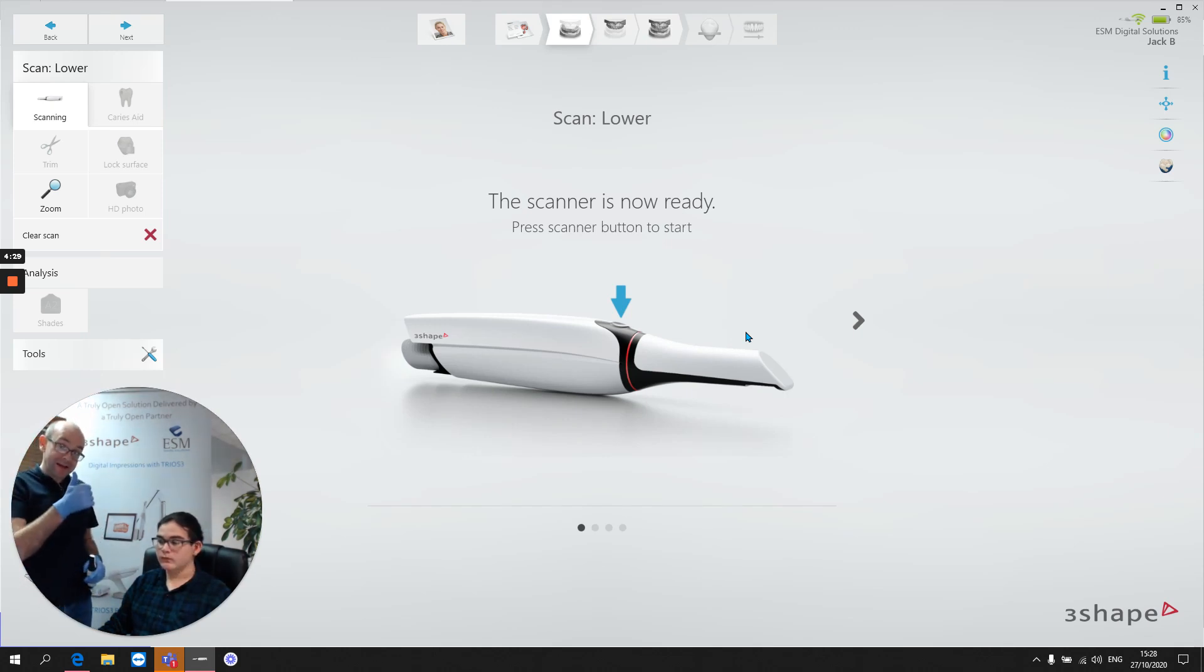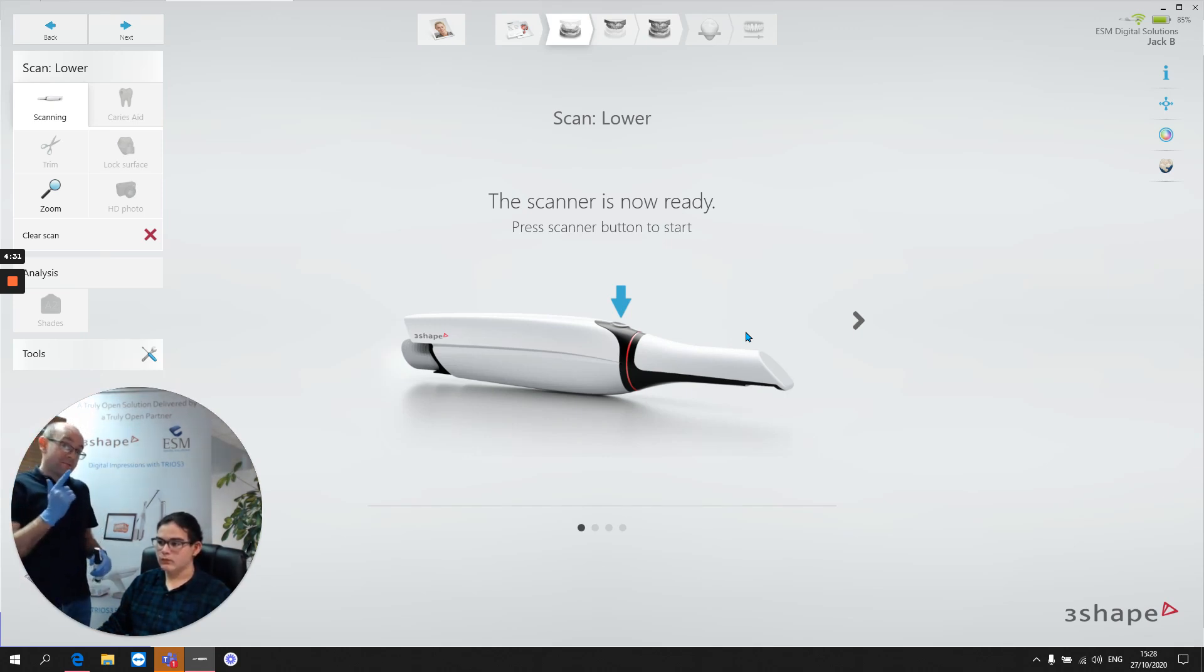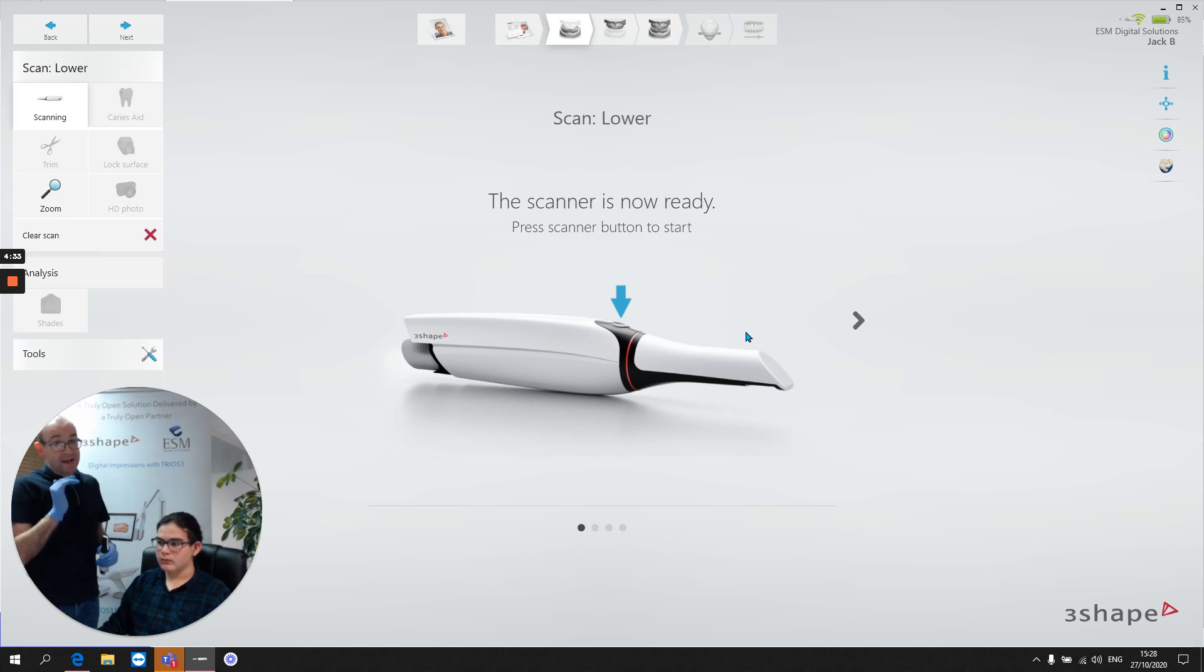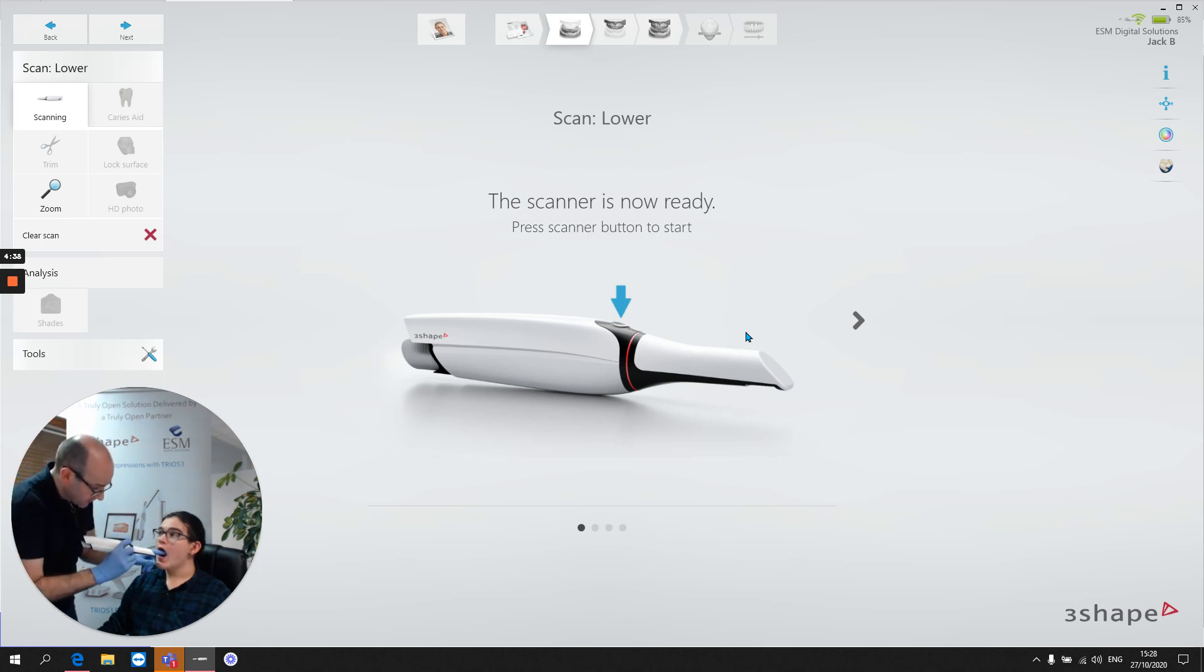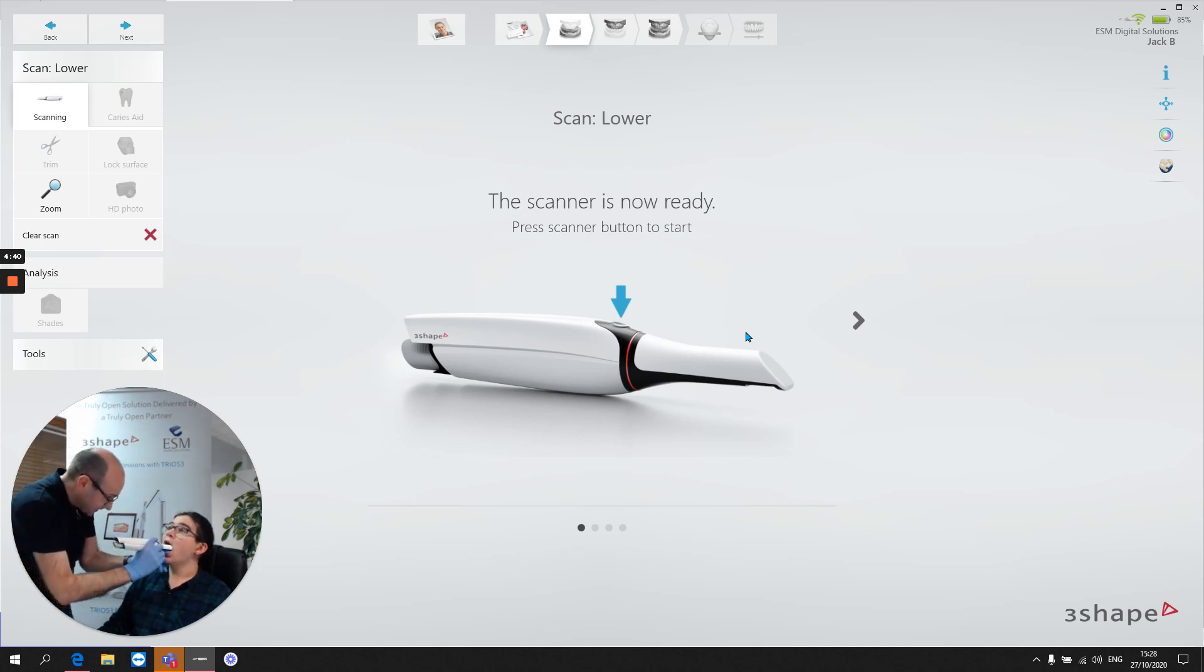So I've shown you a good occlusal scan, I've shown a bad occlusal scan, now I'm going to show a typical occlusal scan and let's see how this one works out. Turn towards me please, head back, relax.